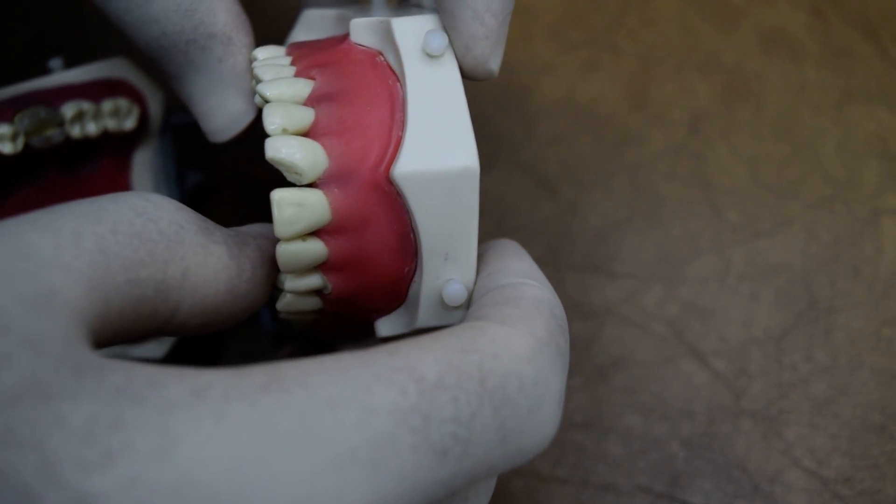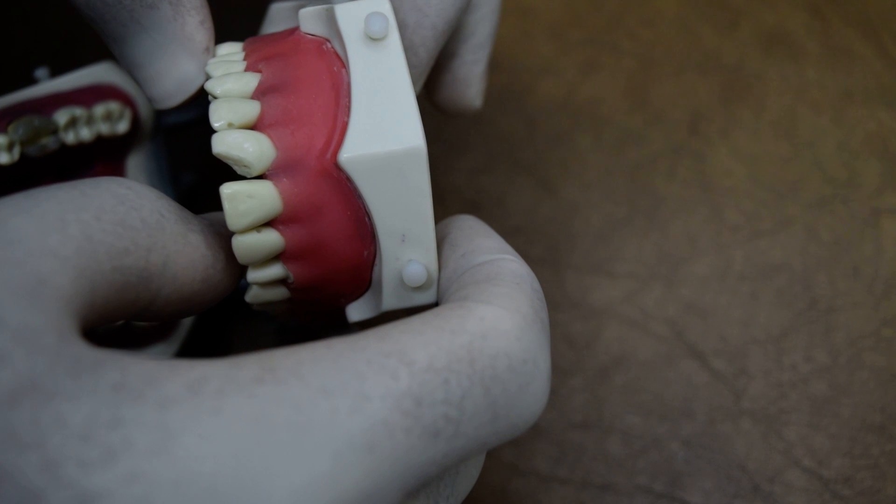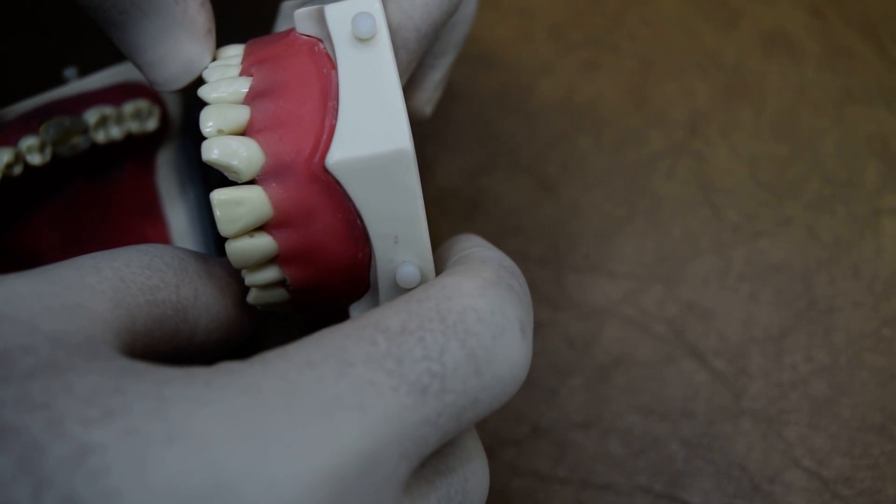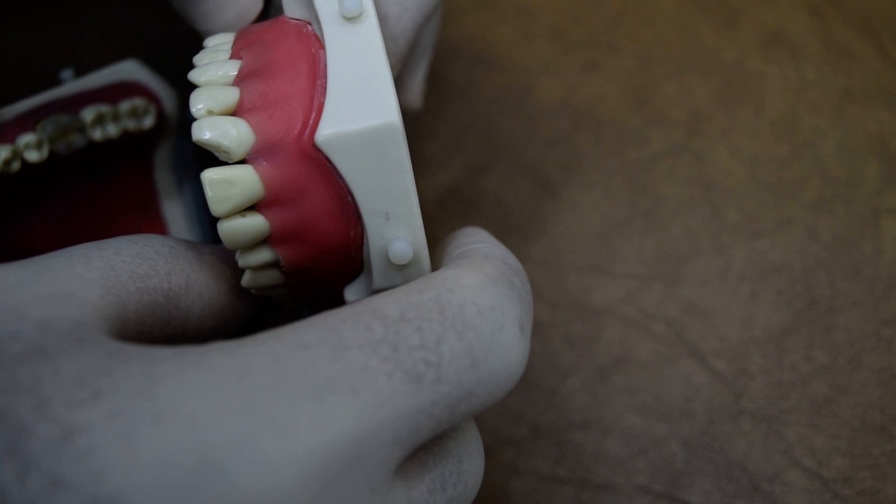Hello everyone, I'm going to show you today how to do class 4 composite restoration on tooth number 11 for the ADC task.